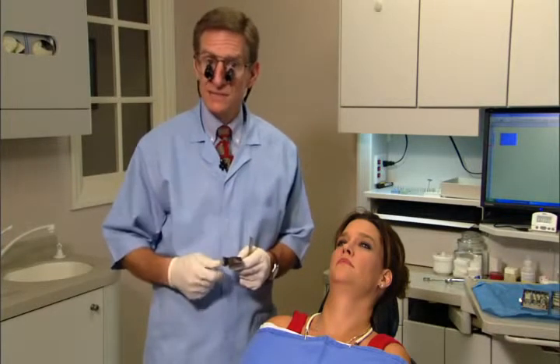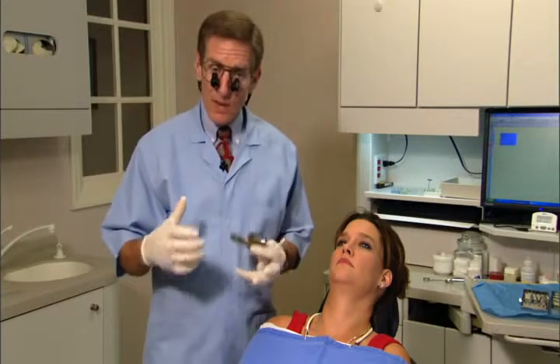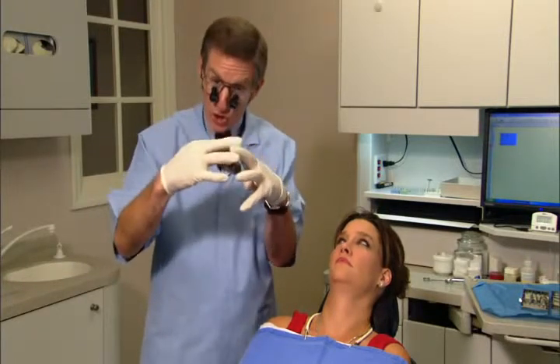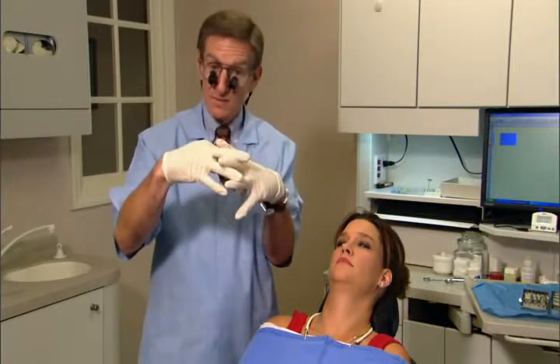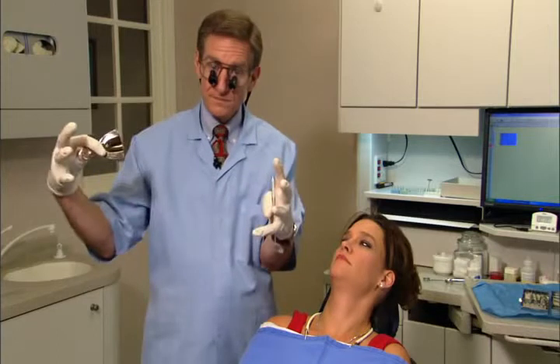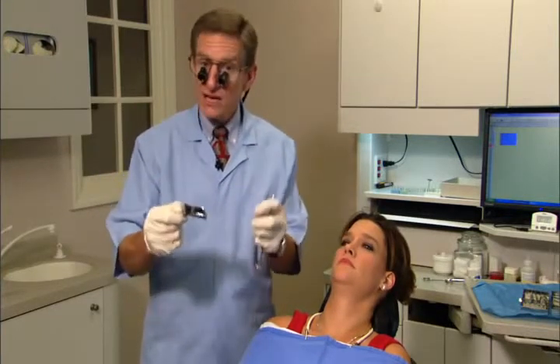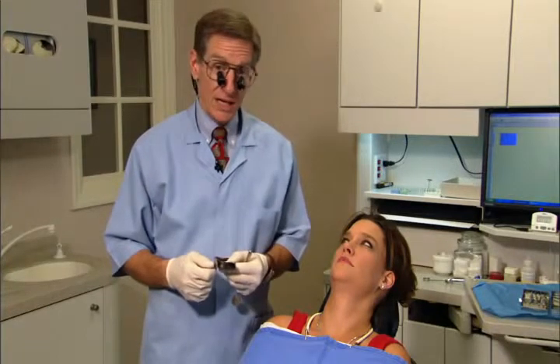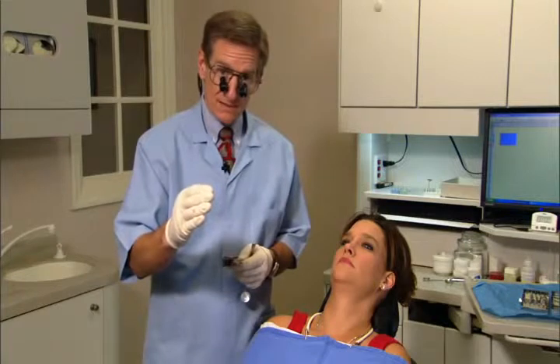Switch to rimlock trays and use regular set alginate. Regular set is more accurate than fast set. Alginate sets by a brush heap configuration — as it sets, it piles up. Fast set uses bigger limbs that pile up faster, but regular set is far more accurate, like piling with grass versus large limbs. In terms of accuracy, use regular set.